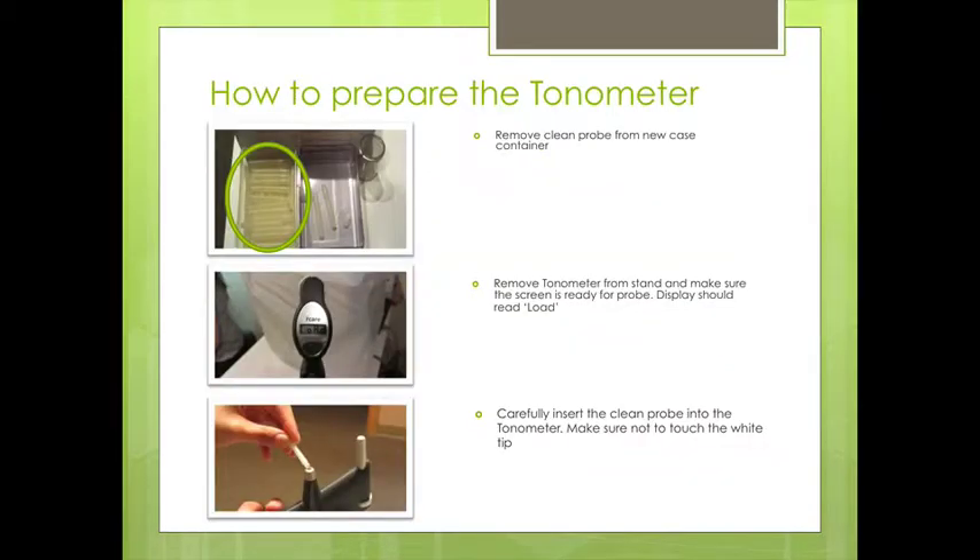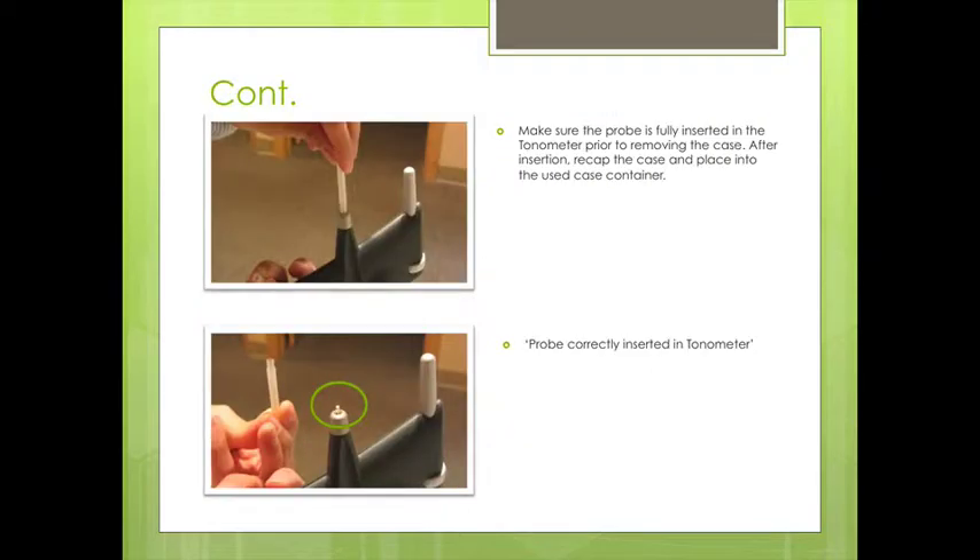In our office we have these probes, and we remove a clean probe from the case. We remove the tonometer from the stand and make sure that the screen is ready for the probe — it should say 'Load.' Then we carefully insert the probe into the tonometer, making sure not to touch the white tip. Make sure that the probe is fully inserted, then recap the case and place it into the used container.